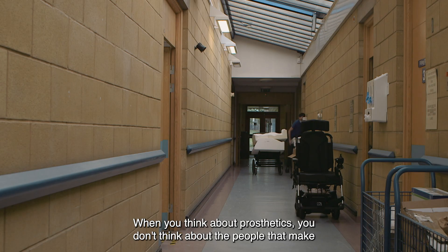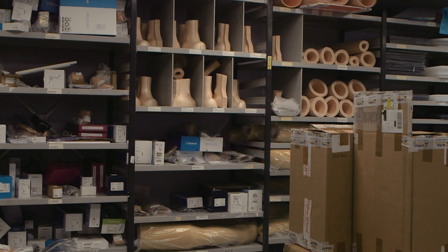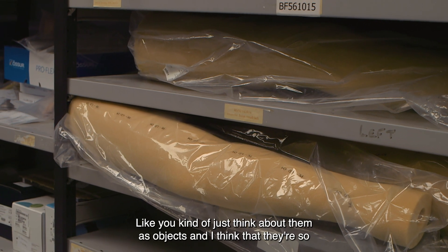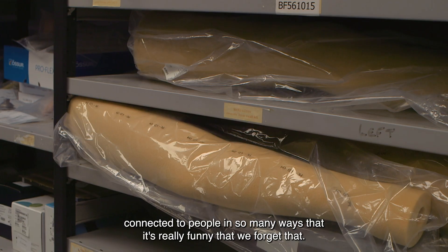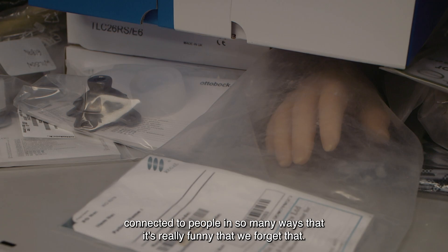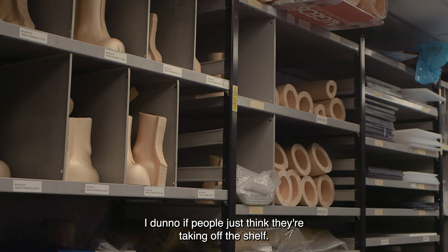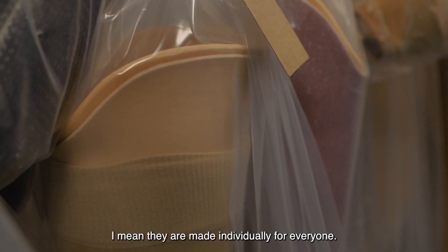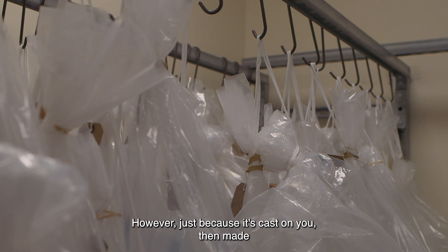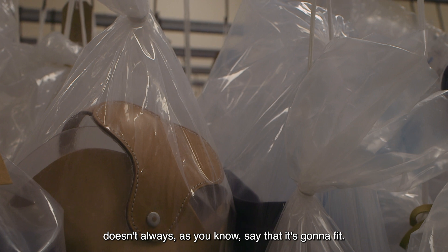When you think about prosthetics, you don't think about the people that make them or really even the people that wear them. You kind of just think about them as objects, and I think that they're so connected to people in so many ways that it's really funny that we forget that. I don't know if people just think they're taken off the shelf. I mean, they are made individually for everyone — however, just because it's cast on you then made doesn't always mean it's going to fit.